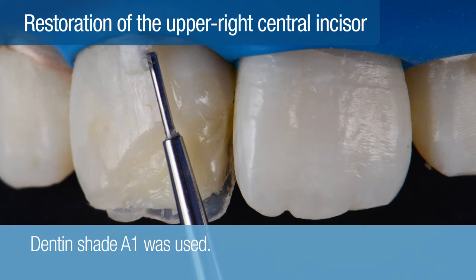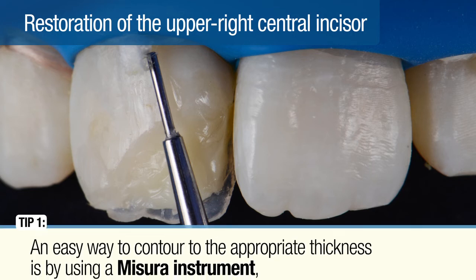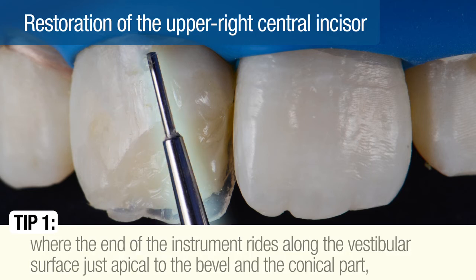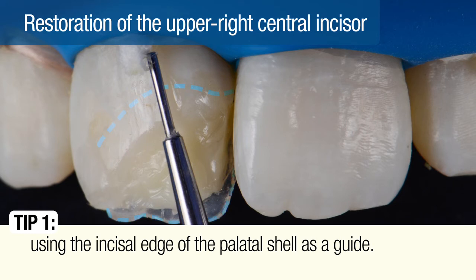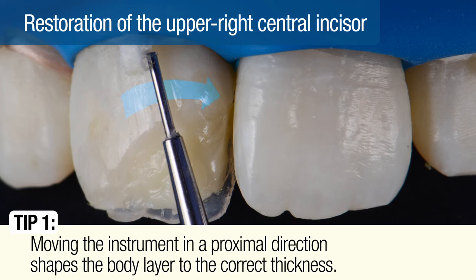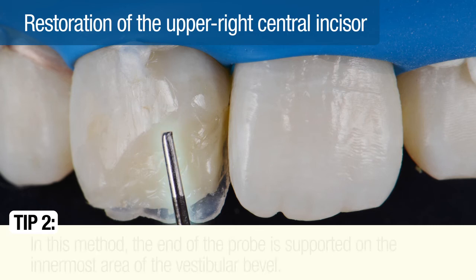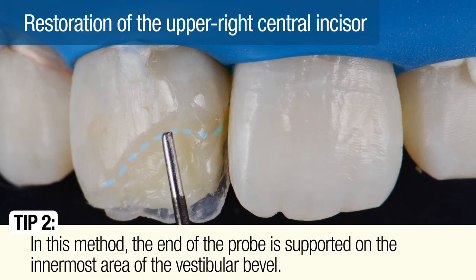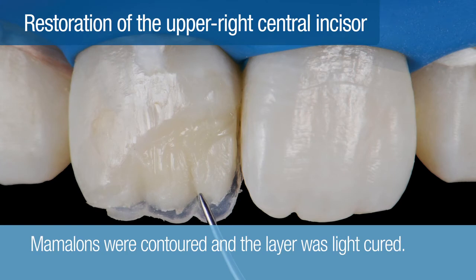Dentin shade A1 was used to create the body of the restoration, shown here after placement on the palatal shell. It's important to contour this layer to a thickness that leaves 0.5 millimeters for the overlaying enamel layer. An easy way to contour to the appropriate thickness is by using a Missouri instrument where the end of the instrument rides along the vestibular surface, just apical to the bevel, using the incisal edge of the palatal shell as a guide. Moving the instrument in a proximal direction shapes the body layer to the correct thickness. The desired body shade thickness can also be contoured using a periodontal probe, with the end of the probe supported on the innermost area of the vestibular bevel and the distal edge guided by the incisal edge of the palatal shell. After the body of the dentin layer was shaped to the correct thickness, mamelons were contoured and the layer was light-cured.